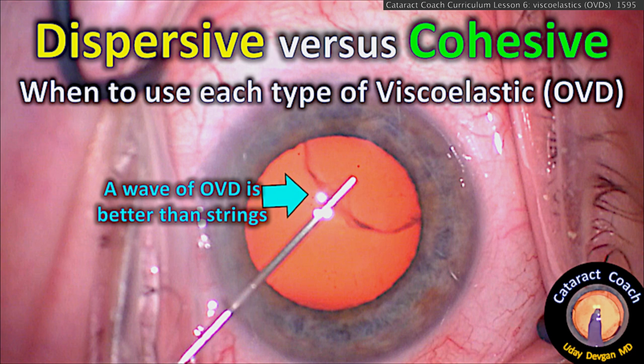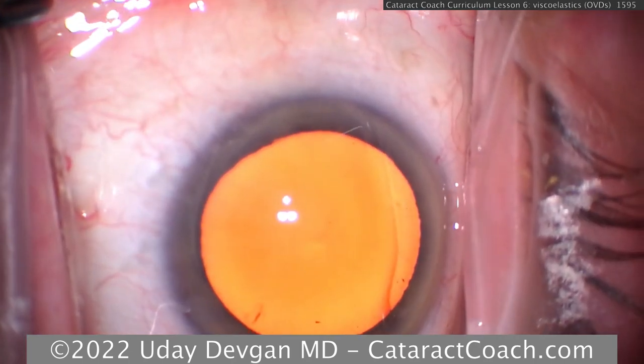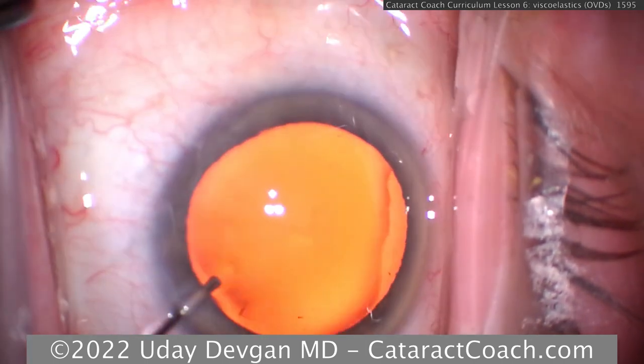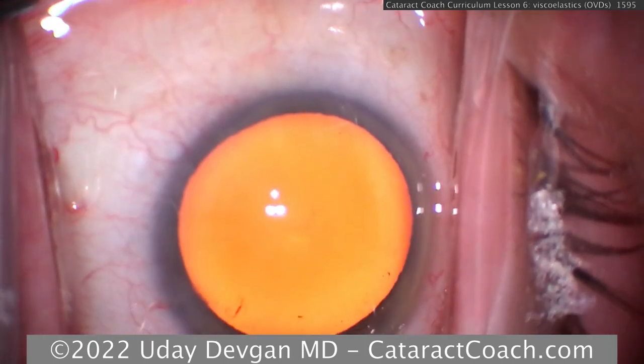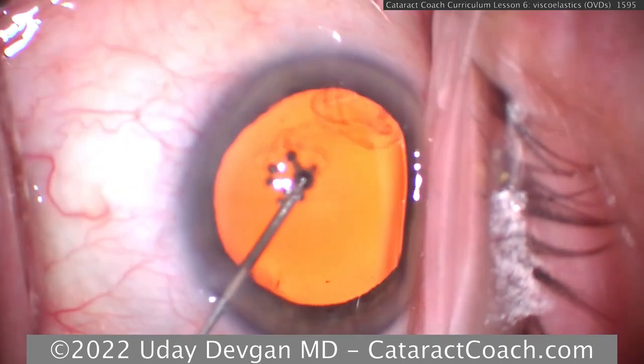CataractCoach.com. Dispersive versus cohesive viscoelastic. When to use each type of OVD, ophthalmic viscosurgical devices. Now, viscoelastics, also referred to as OVDs, ophthalmic viscosurgical devices, are viscous substances that allow us to make phaco easier and safer. Now, there are many viscoelastics on the market.